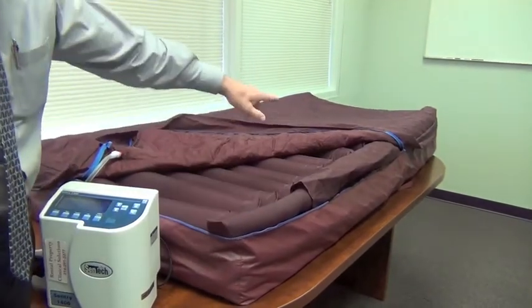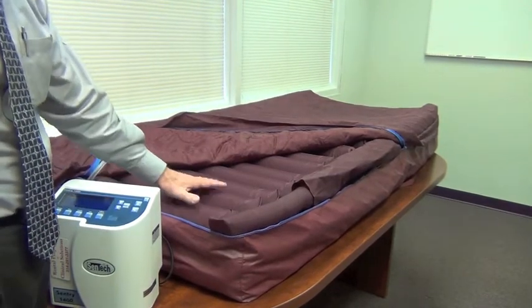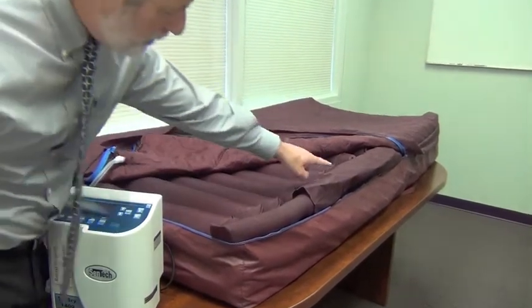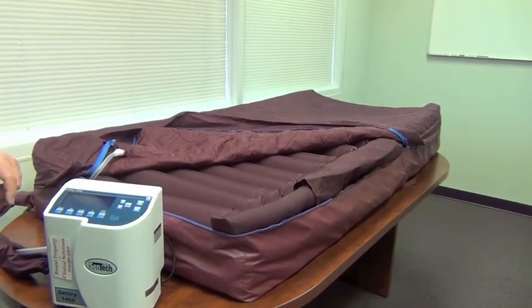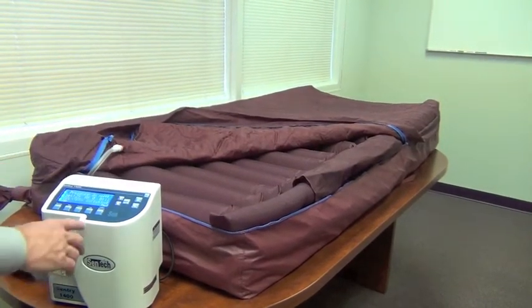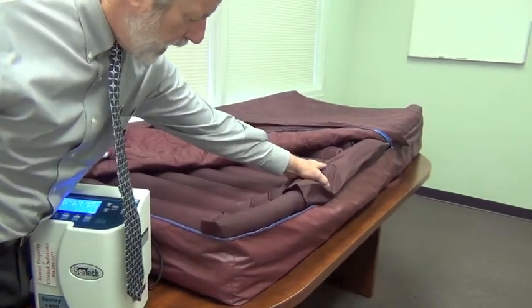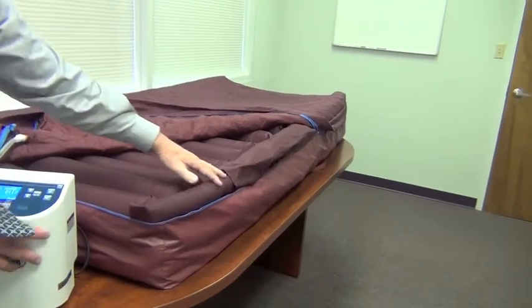It runs head to foot. It gives substance and integrity to the mattress itself, and on top of it are the accessory bolsters that I talked about. And I'm going to turn the unit on here just quickly and inflate these accessory bolsters. You can see right now they're flat. There's no additional height here.